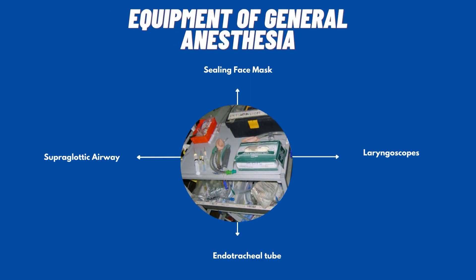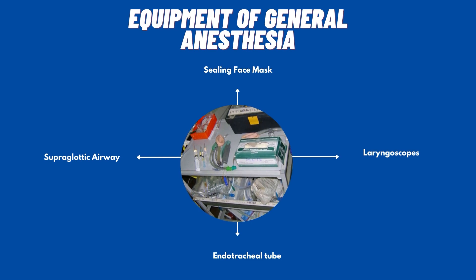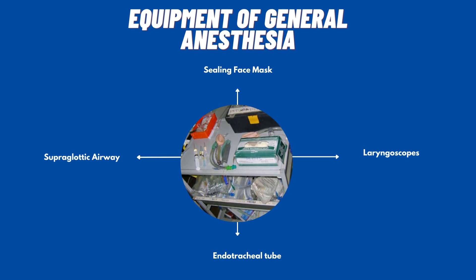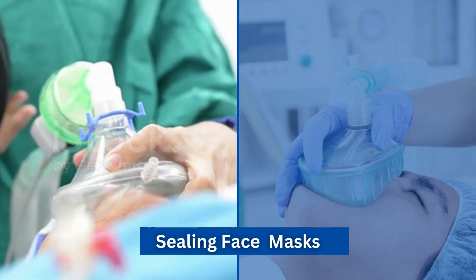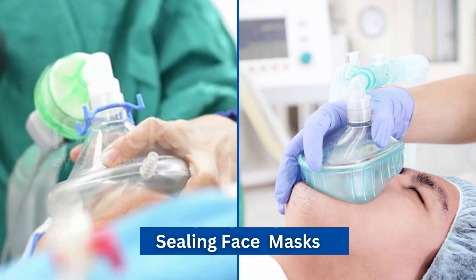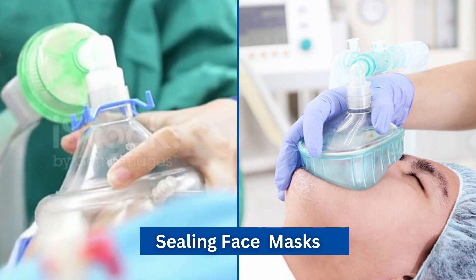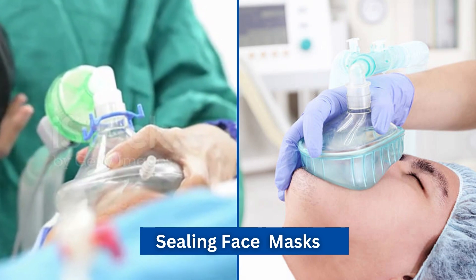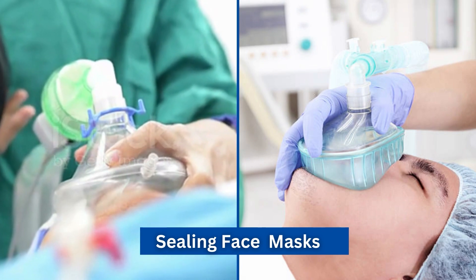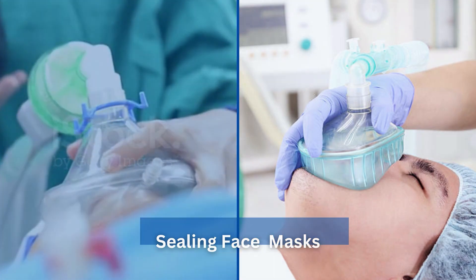In this particular video, we will talk about masks, supraglottic airways, laryngoscope, and endotracheal tubes. Starting from the face mask — it has a soft seal that fits over the patient's nose and mouth. This seal is effective for giving 100% oxygen by non-invasive positive pressure ventilation.